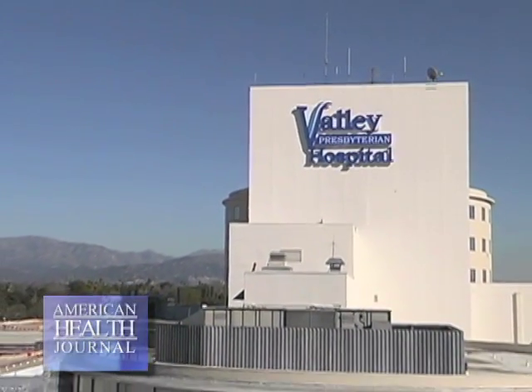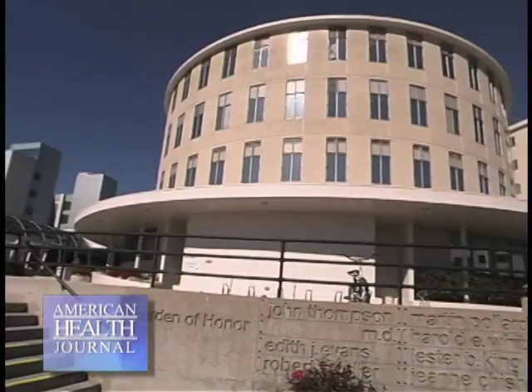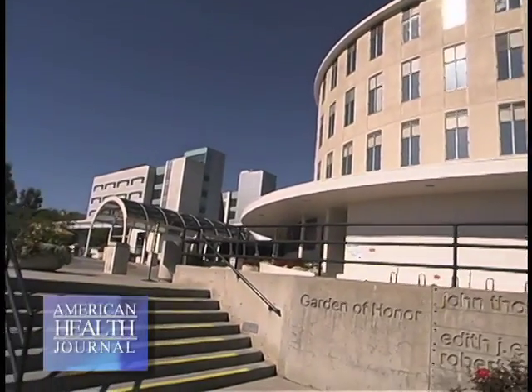We spoke with Dr. Laurence Shaw at Valley Presbyterian Hospital in Van Nuys, California, who describes how the cooling blanket functions. A cooling blanket is a method of treatment to assist infants who've had distress or difficulties before and during their delivery to have a better outcome.